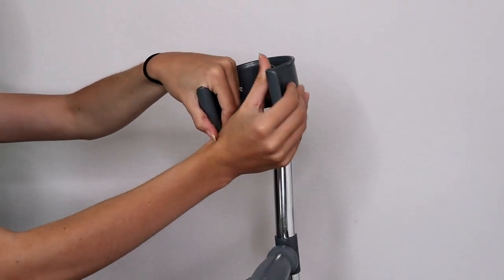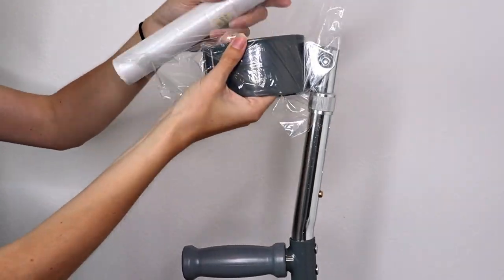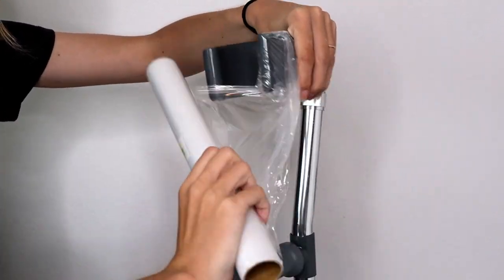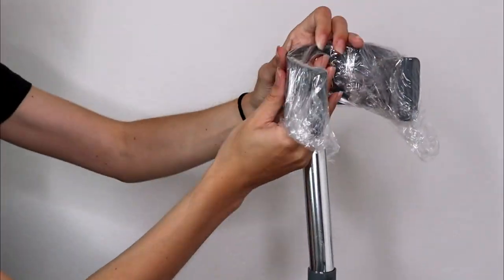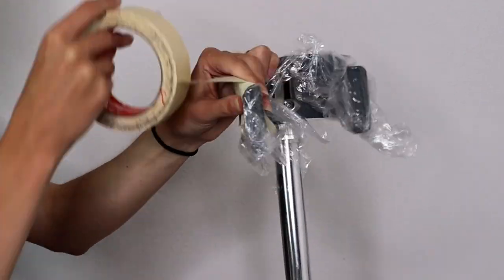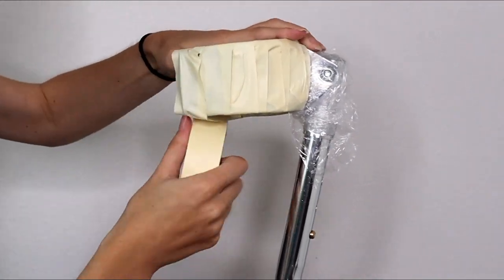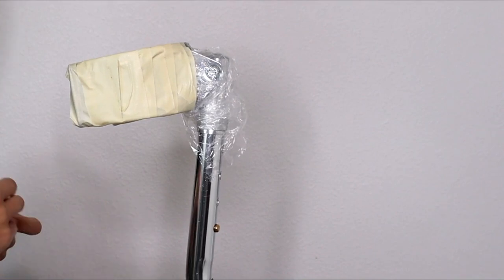First we're going to need to pattern out the cosplays, and that means we're going to have to cover the mobility aid in saran wrap. I'm going to take Reginald and do my best to cover him in saran wrap — it was very difficult because he was so curvy. Then I'm going to take masking tape and go over that saran wrap. If there are any hinges, locking mechanisms, or anything you want to move or access, do not cover that in masking tape.